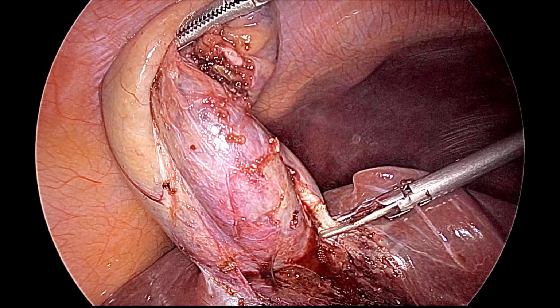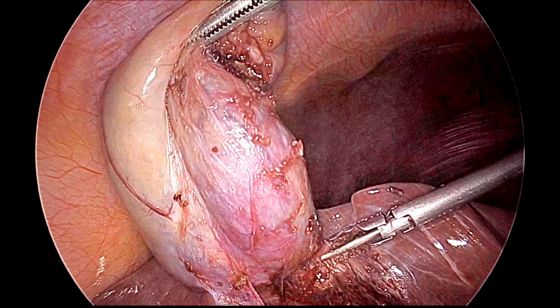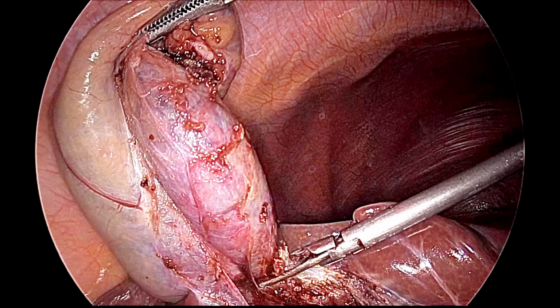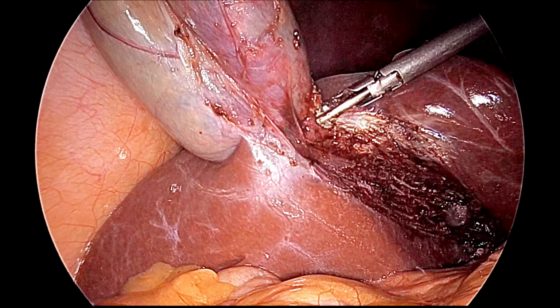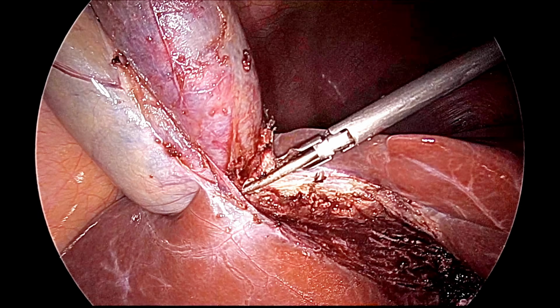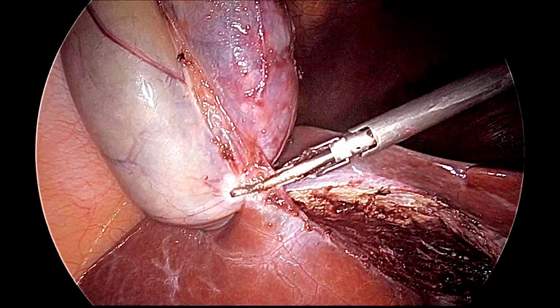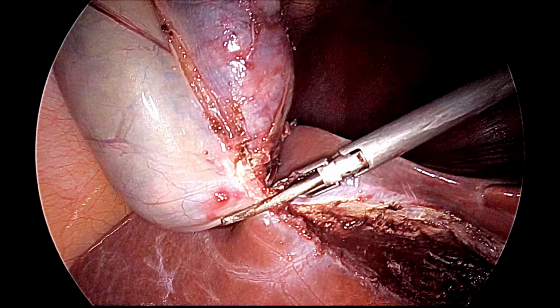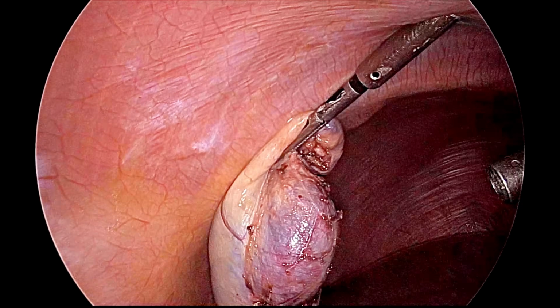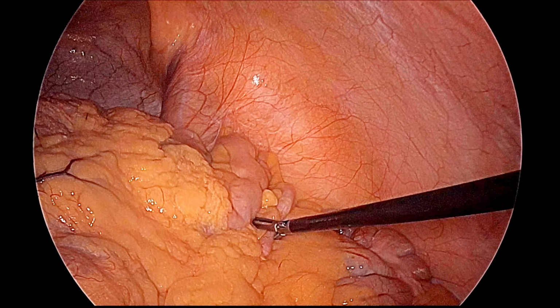So we can see this is the final dissection, and before that you can have a final inspection, and then the gallbladder will be separated from the liver. Once the gallbladder is separated, then we will keep it on the Morrison's pouch and we will transfer the telescope to the epigastric region. So cholecystectomy is over.